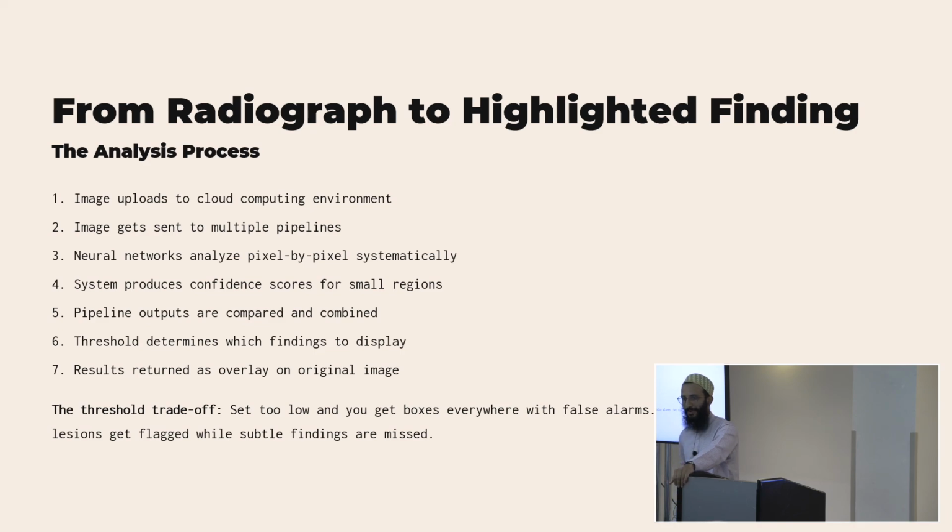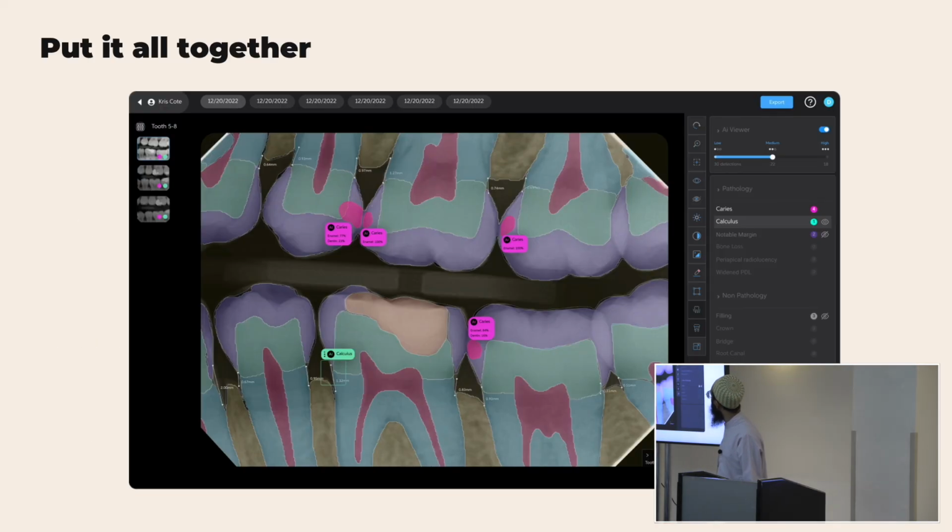In the EU, surprisingly, it's a little bit more open. In the EU and the rest of the world, basically that slider exists. And I'll show you in the picture here. This is what the slider is. So low, medium, high.